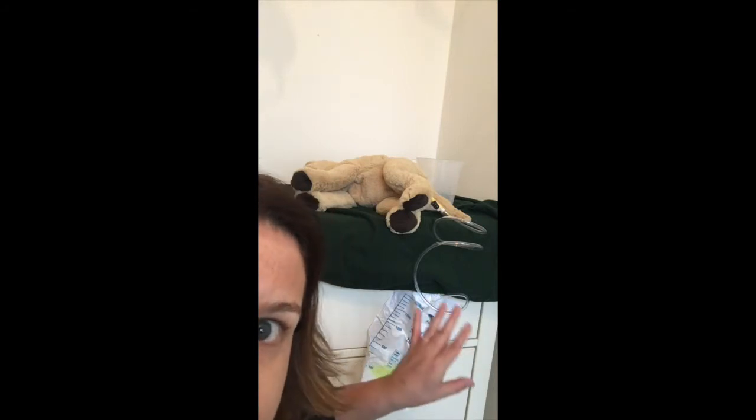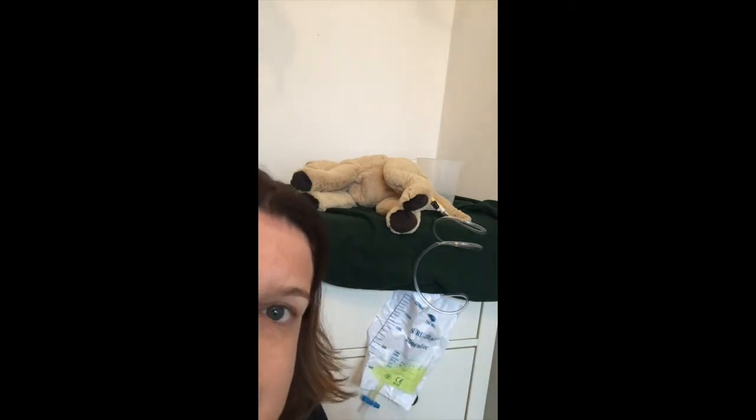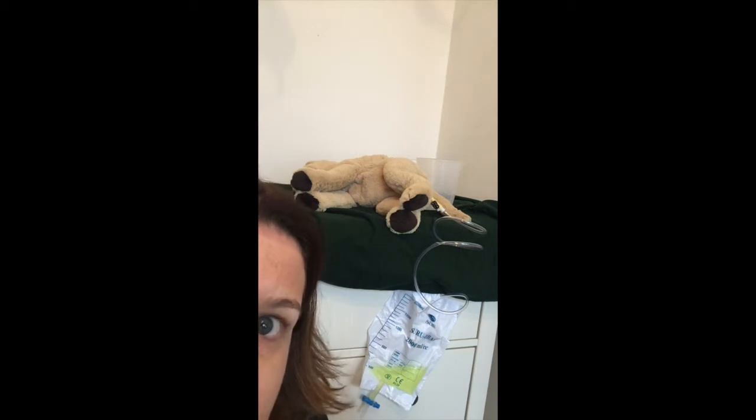So we have our patient, we have our urine. I'm going to stand up and go out of shot just for a sec, and then I'll come back and I'll tell you what I'm doing.